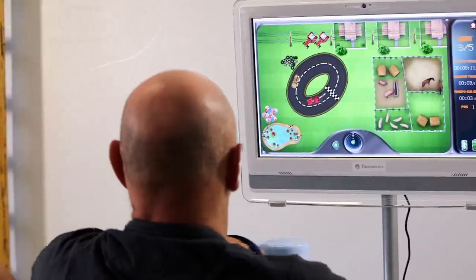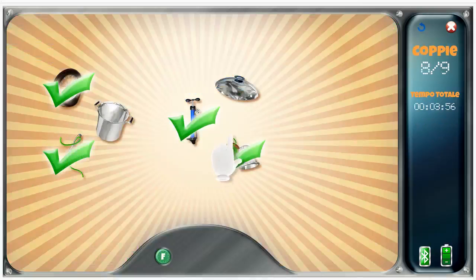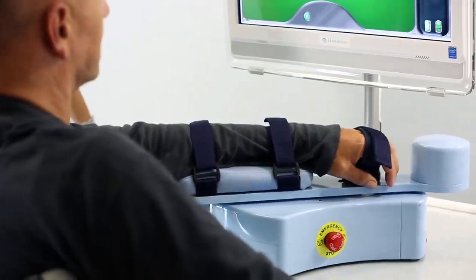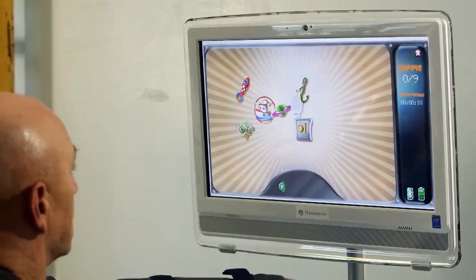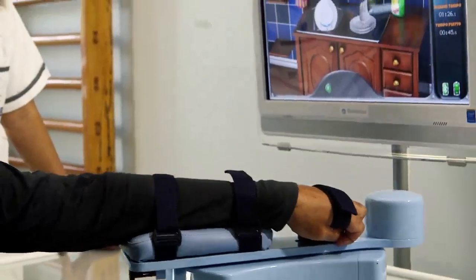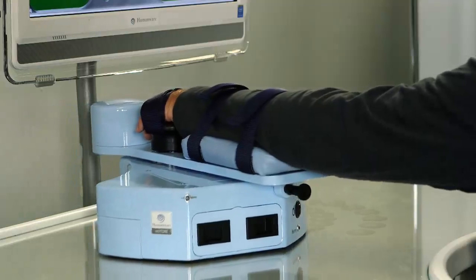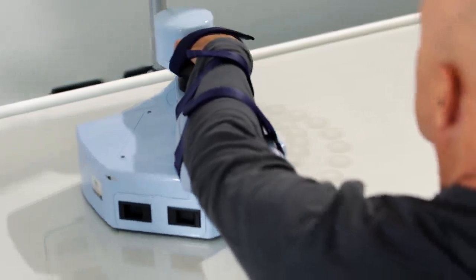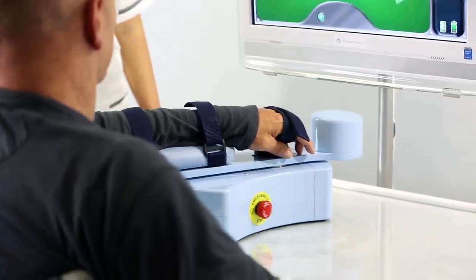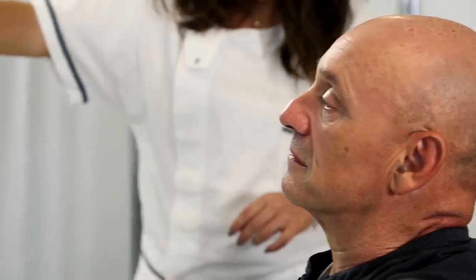With Motore, patients are involved in a new kind of therapy consisting of games and puzzles which challenge them physically and cognitively. Visual feedback, force feedback, and acoustic feedback stimulate all senses and the whole neuromotor system. Motore moves smoothly on the desk. It intervenes to avoid spasms while exercising and to reduce spasticity of muscles in mid-term treatment.